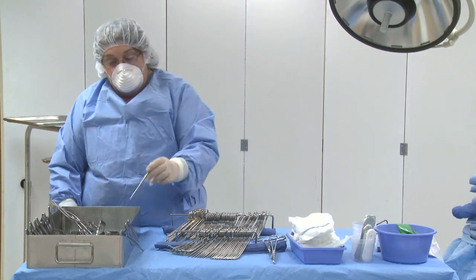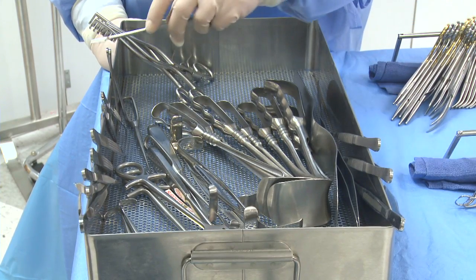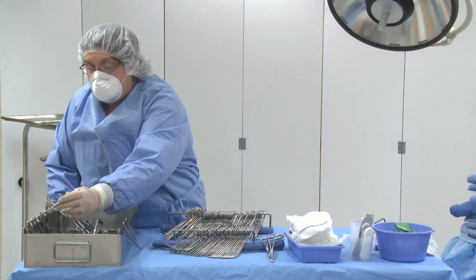Next we'll count the forceps as one group: 1, 2, 3, 4, 5, 6, 7, 8, 9, 10, 11, 12.